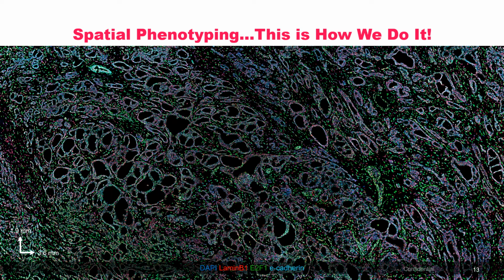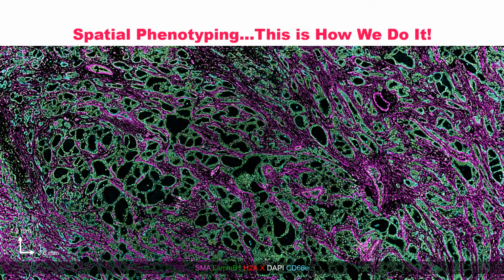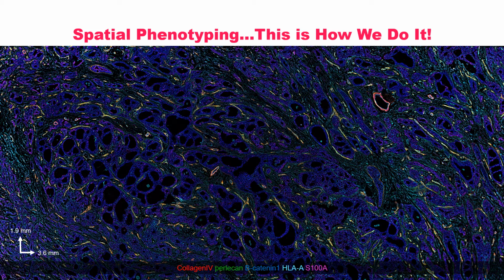As you can see here, we see a tissue of 2 millimeters by 3.5 millimeters, so quite a good size. Every antibody, every marker, is color-coded with the color you like. As I'm toggling through those different images, you can see those different markers represented on every image. I'm not an expert in breast cancer or breast tissue, but I know breast tissue is known to have many different types of epithelial cells. So for this specific breast cancer panel, it's a lot of epithelium markers.